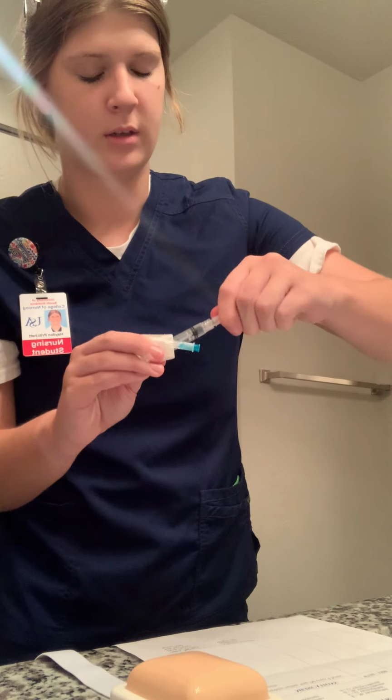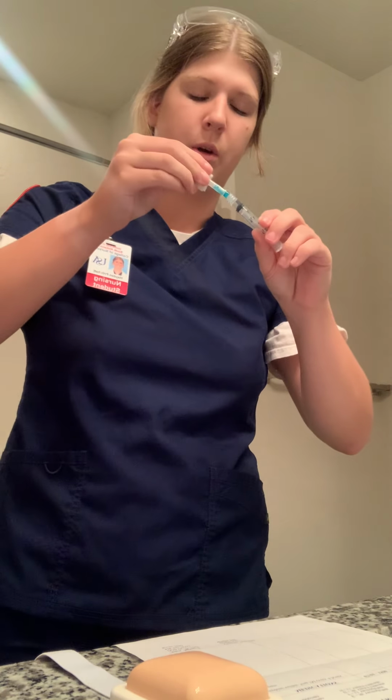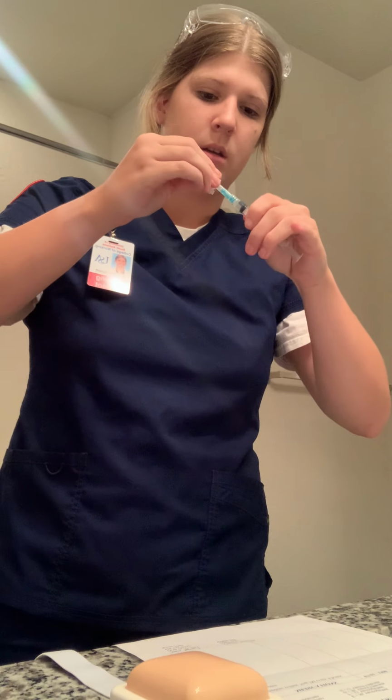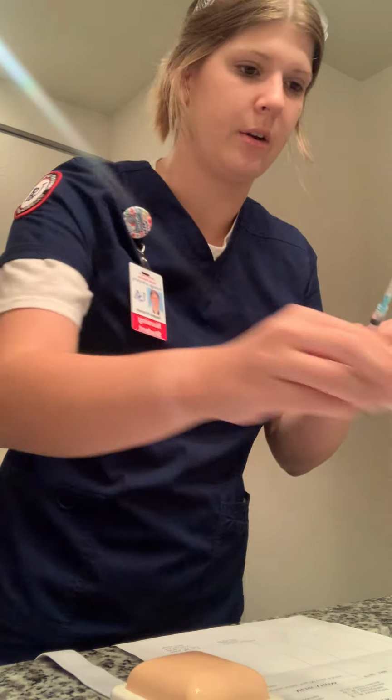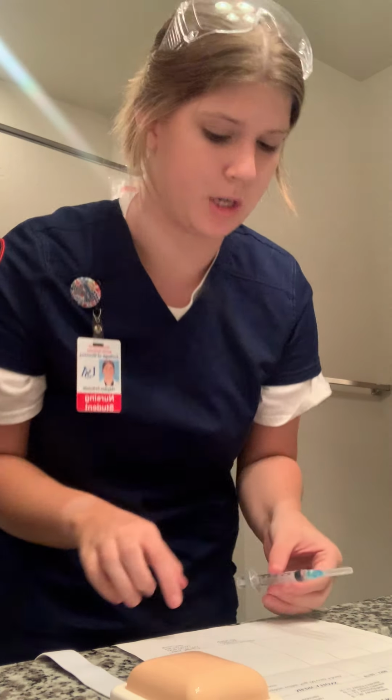I'm going to get rid of this cannula now in my sharps container, and I'm going to put this on here now. So now my syringe is ready to go. So I'm going to go through and check this again.